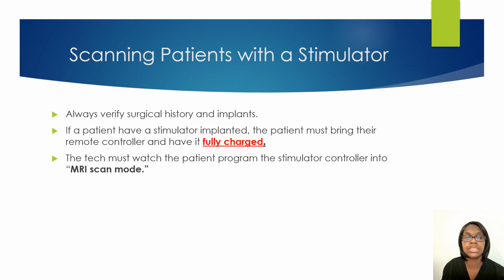And also watch your patient program the stimulator into MRI scan mode. There was one time I had a patient who tried to program their stimulator into MRI scan mode and it wouldn't go into the mode. But I told the patient, I have to watch you do this. You cannot do it on your own. I have to see you do it. So the stimulator would not go into MRI scan mode, and the patient had to reschedule.